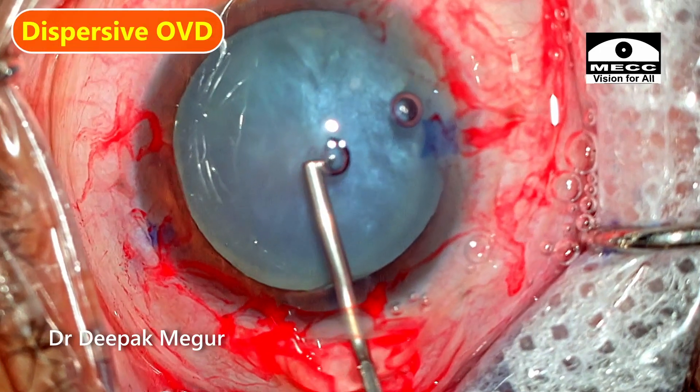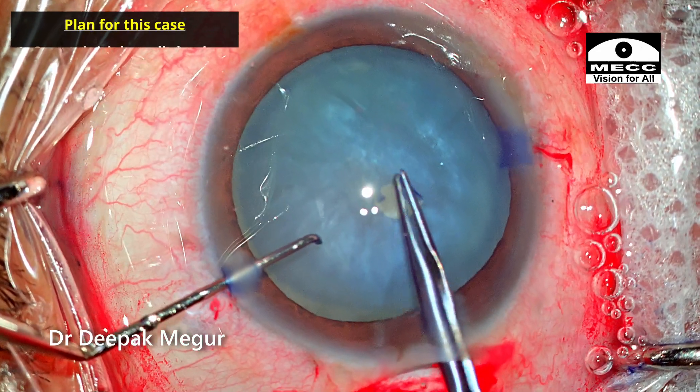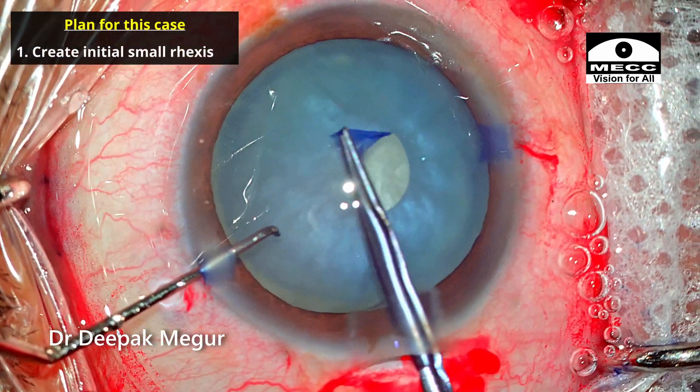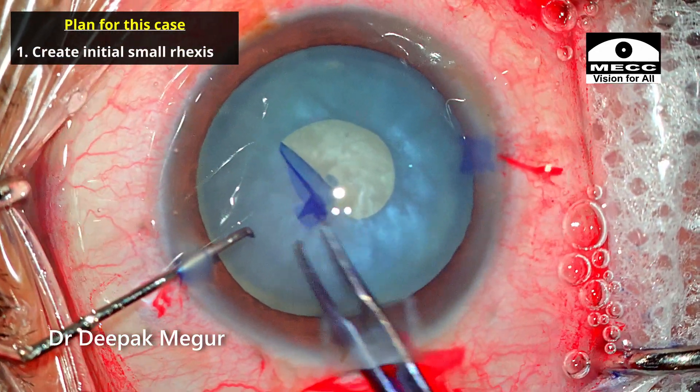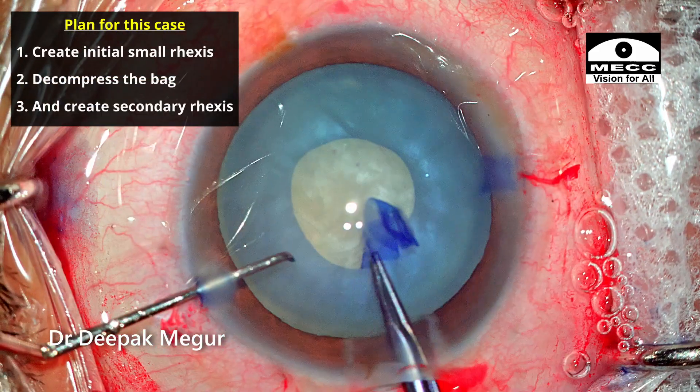I'm using dispersive OVD to deepen the chamber. The plan is to perform an initial small rhexis about 3 to 3.5 mm, decompress the bag, and then enlarge and make a secondary rhexis.